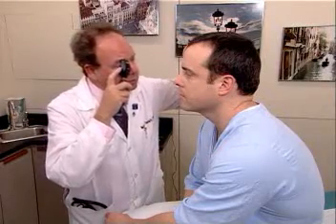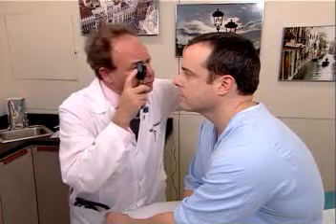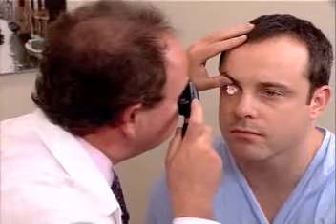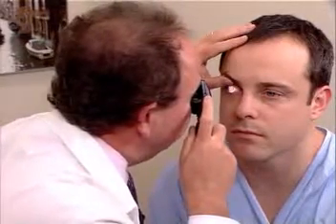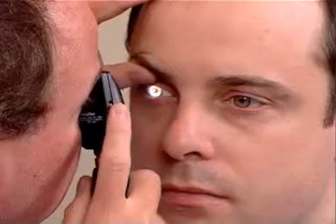As you move closer to the patient, you will turn the lenses to focus deeper as one gets into the eye, past the lens, through the vitreous, and then into the retina. You must always be at eye level with the patient.